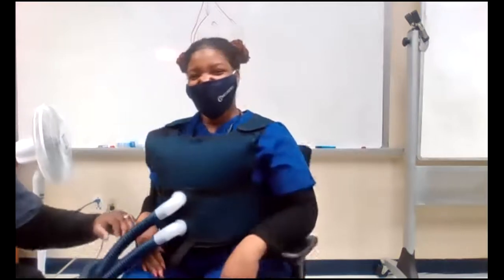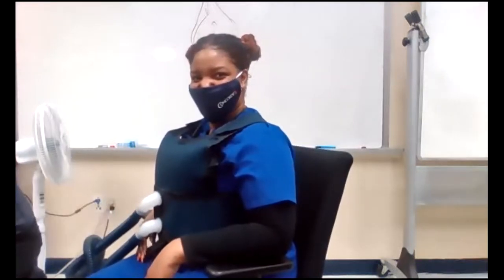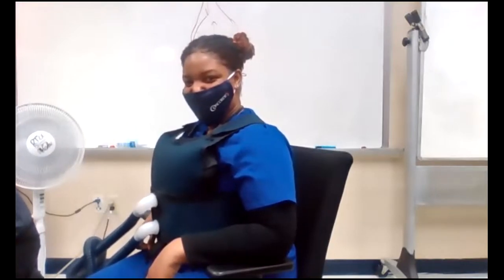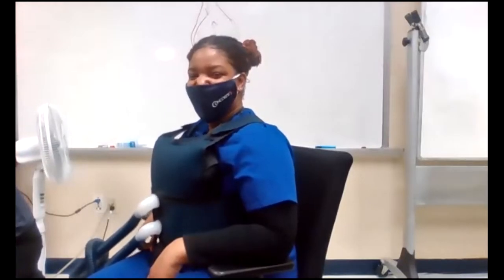Turn to the side. Yeah. How does that feel? So that is the high frequency chest wall oscillator. Oh, yeah. I need one of these in the house for no reason.